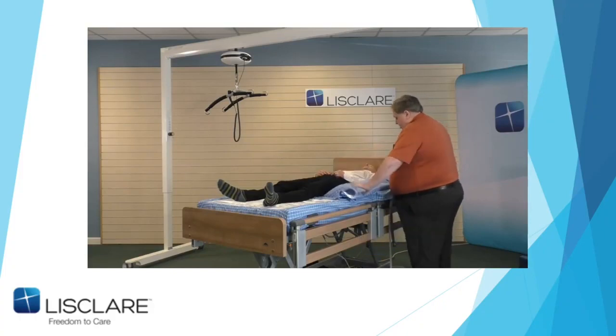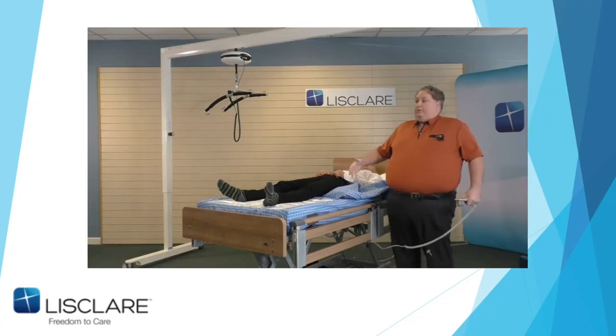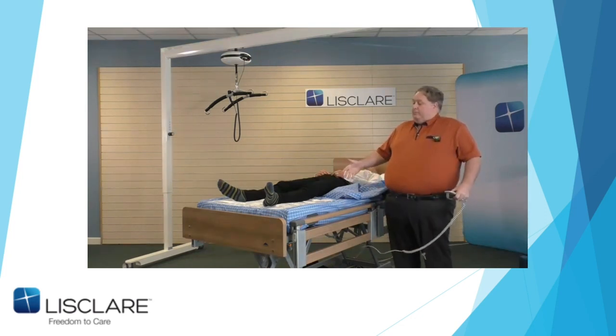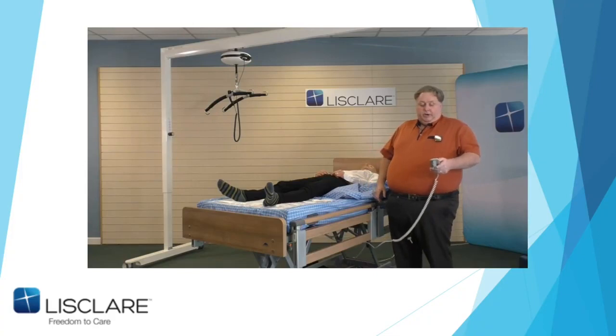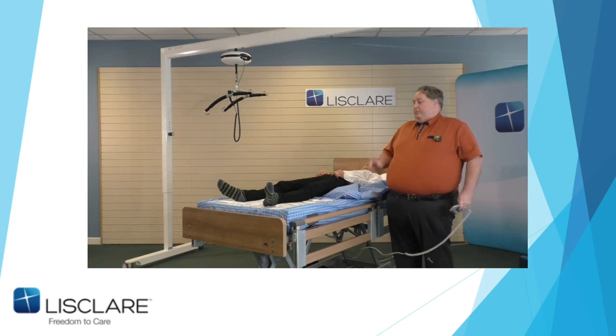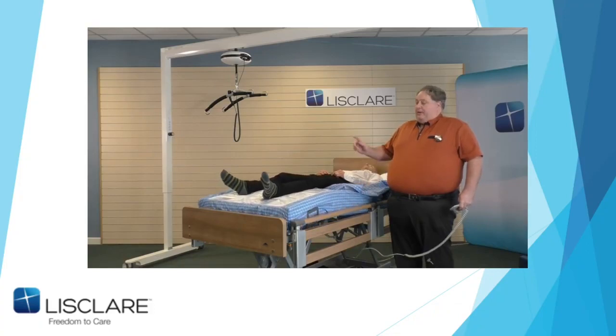Now, why patients come down the bed in the first place is to do with the profiling of the bed. Unfortunately, the human body doesn't profile the same way as a nursing bed. And again, there's a lot of reactions from clients or people in bed that they don't do certain things in a way. They seem to stiffen up. So if I sit John up, okay, I'm just going to elevate the leg rest section first. Not easy to say. Now again, during this demonstration, you'll see John's feet stand down.